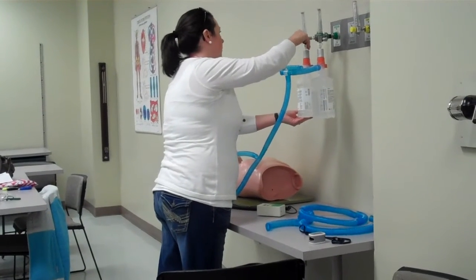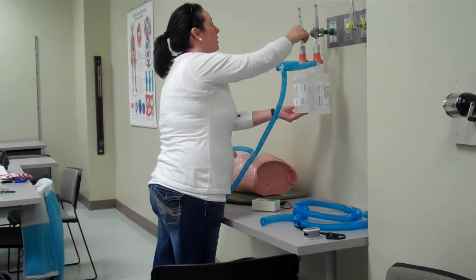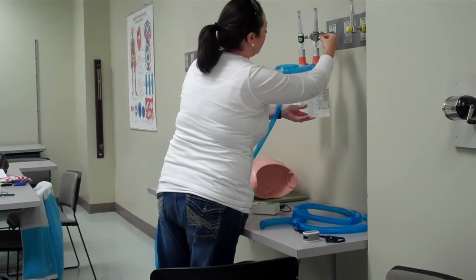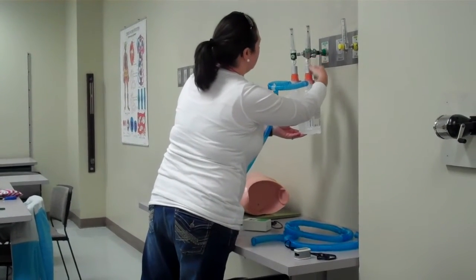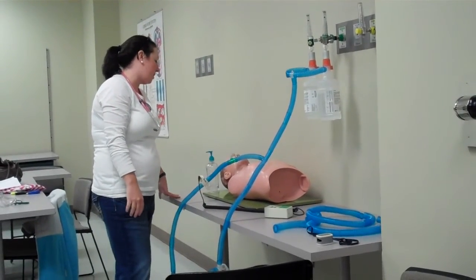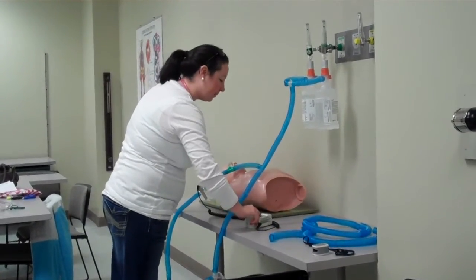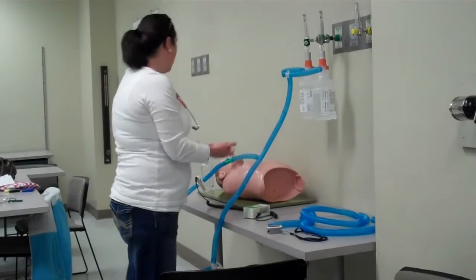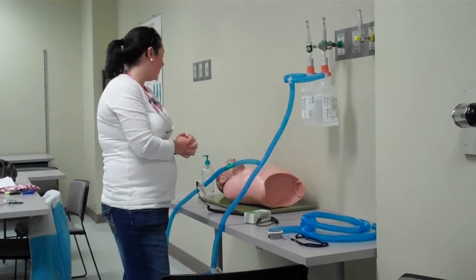I'll go ahead and turn this on very slowly. Do you feel okay? Just let me know if you feel weird, if anything doesn't feel right, or if it's really uncomfortable — even a short breath — any of those things. You want my brother to just nod to you? Yeah, just nod to me — blink twice if it's okay, once if it's not. We're going to assume he blinked twice. It analyzed at 40%, that's good — we're analyzing at our 40%. I'm going to recheck his heart rate, respiratory rate, SpO2, color, and level of dyspnea as I'm sitting here doing this.